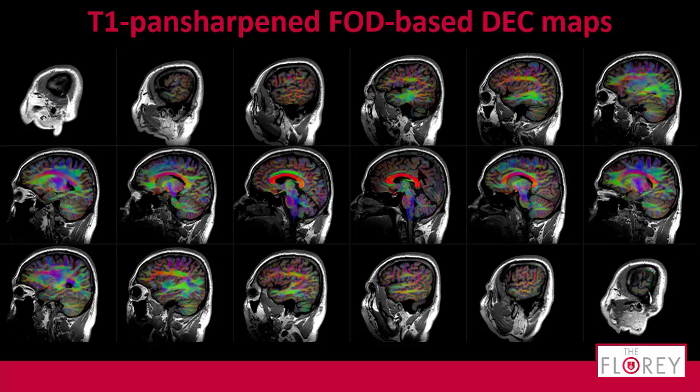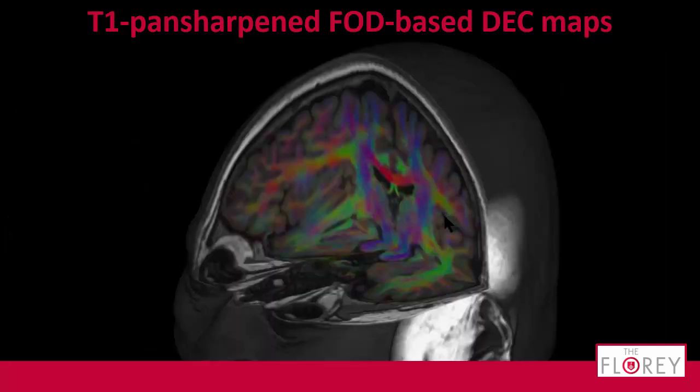Very pretty things as well. It's just one volume. That's quite handy. So this is a light box view. You can readily do this in MRtrix. It's very easy. You can scroll. Quite nice. Well, nice delineations. Corpus callosum is in there because it's in the T1. Just like that. You can do volume renderings as well.